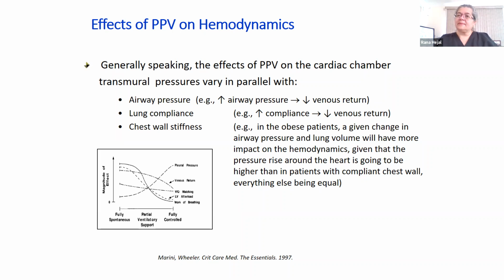You stay there. As they get better and their compliance improves, you allow a little bit of a better tidal volume, as long as their pressures are still on the low side. And when you liberate them from everything and you believe they are ready to be extubated, if their tidal volumes increase significantly and you are below their limits, it's one of two things.